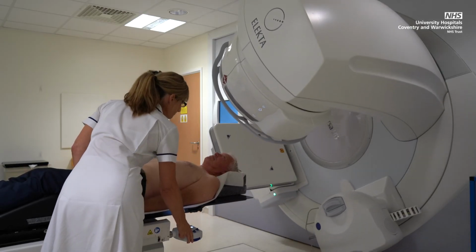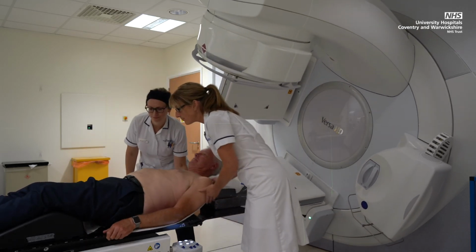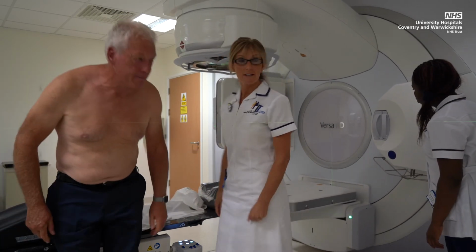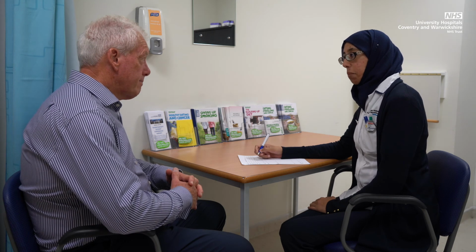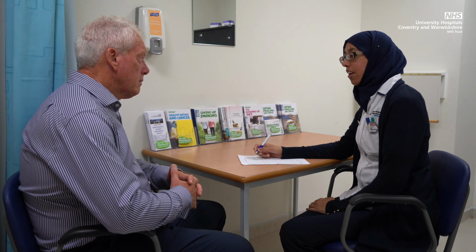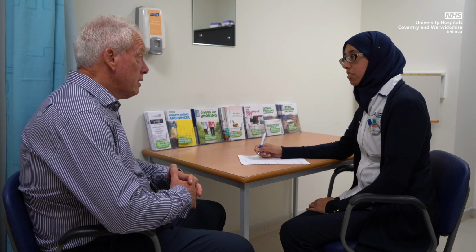Patients are usually in the treatment room for around 15 minutes. Most of that time is ensuring that you're in the correct position for treatment. The treatment itself only lasts a couple of minutes. On the first day, the radiographers will give you your full list of appointments. This may include reviews with your doctor, specialist nurse and Macmillan radiographers. Reviews are an opportunity to talk about your treatment, any side effects, problems, worries or concerns that you may be experiencing. Any questions or problems that may arise during your treatment, please ask the radiographers and they will do their best to help you.